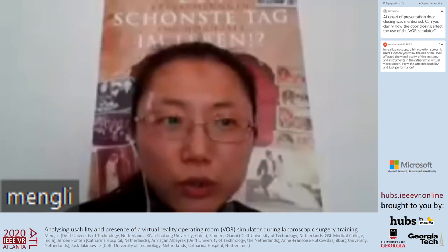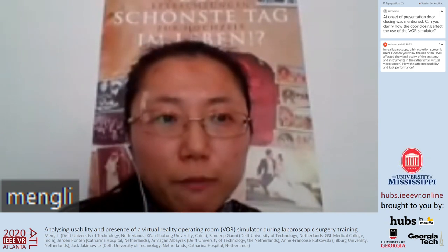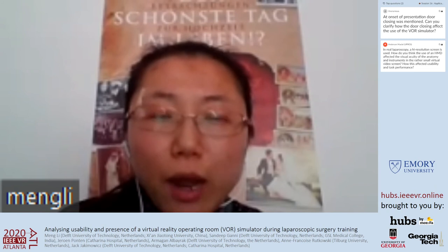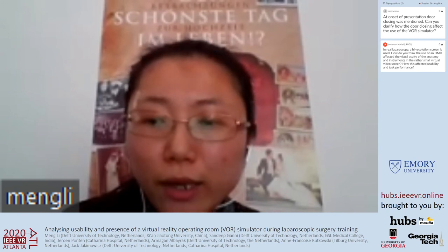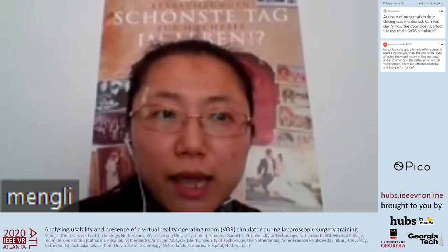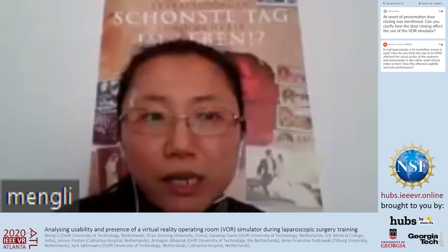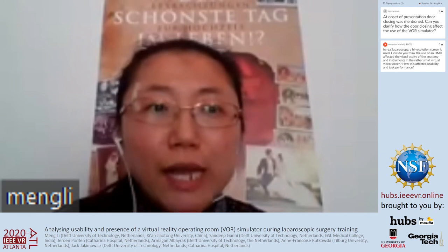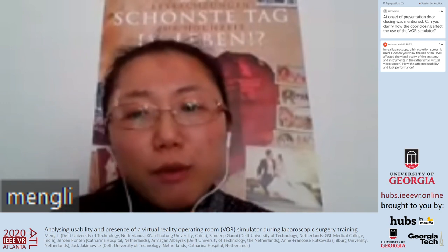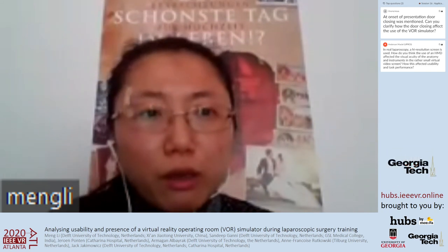Oh, yeah, that is a very good question, actually. A lot of participants noticed that the video resolution was not high enough throughout this procedure. So that is also one of my main points for the limitations of the current version. The visual interface, and also the haptic interface, meaning the haptic resistance of these instruments, are the most important factors to improve the usability, but also the presence.